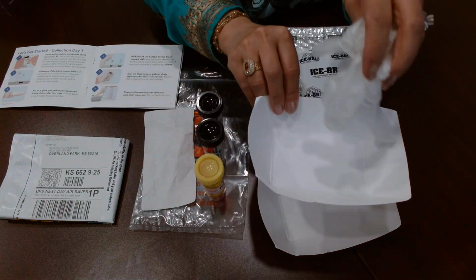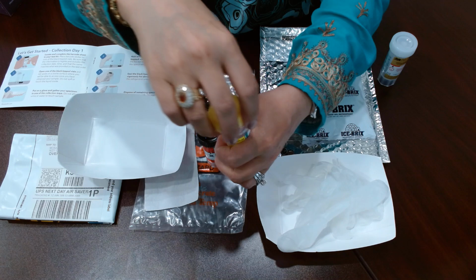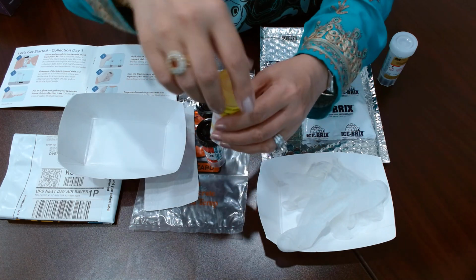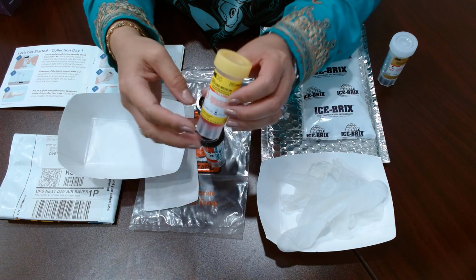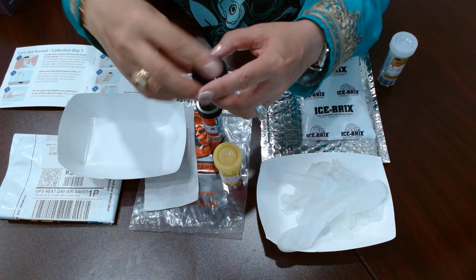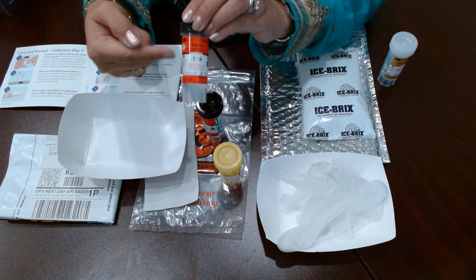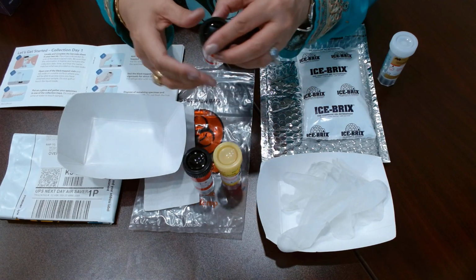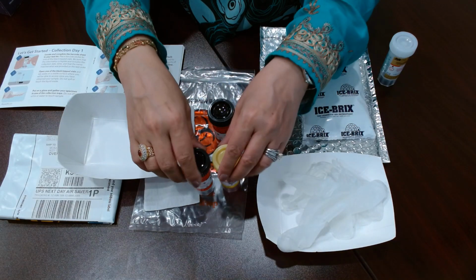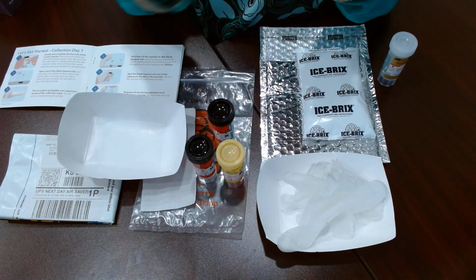Then 12 hours go by, and the next day you take the second collection tray and collect a stool sample in here. This time you remove this cap. This has a little liquid in it. Take stool samples from different locations, put them over here, and shake it for at least 30 seconds, and do not go above this red line. This one is supposed to be refrigerated, so I wrote fridge for the patient. You also mark the consistency of the stool. Anything with the liquid, you shake for 30 seconds so that it homogenizes, and do not go above the red line. Once that is done, you put it in the fridge.